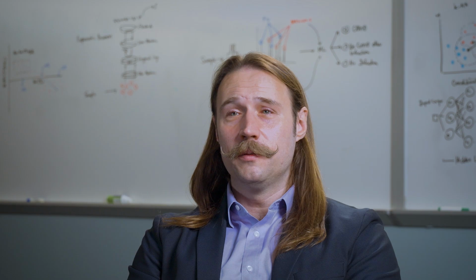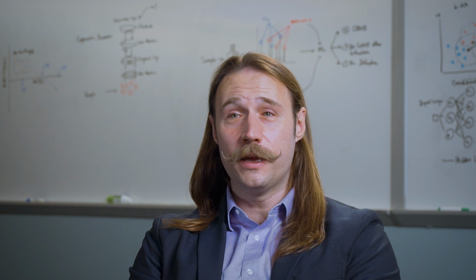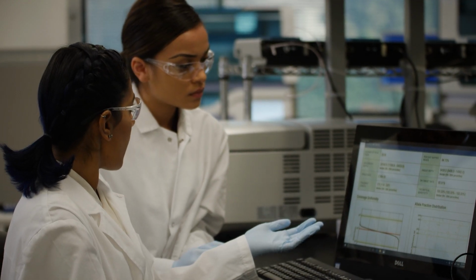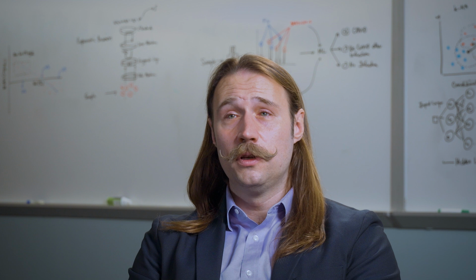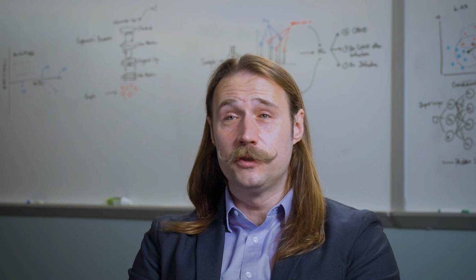And I can see my entire case on one screen. I can zoom in to the specific cells that I want to look at, compare that to immunohistochemistry that I performed on that case, and by comparing this information on one screen, I can make an informed decision about what this information means to the diagnosis and ultimately to the patient. And again, the data that comes from this and that gets stored can now be cataloged, can be searched, can be used for other functions, whether it be secondary consults, whether it be tumor boards, or whether it be something I can't think of right now because we haven't created it yet.